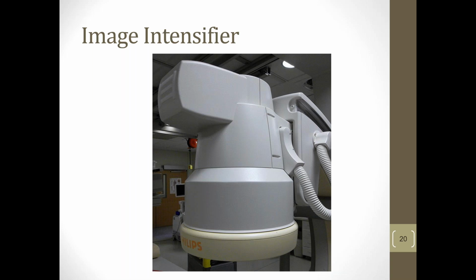Some things did change and improve over time, but this big boxy thing up here is where the camera lives, and we'll cover some of the cameras. In some of the earlier pictures, there were shelves holding the big cameras and stuff. By the end of the time that they came up with the technology, they were able to house all the cameras and everything independently inside the II itself.